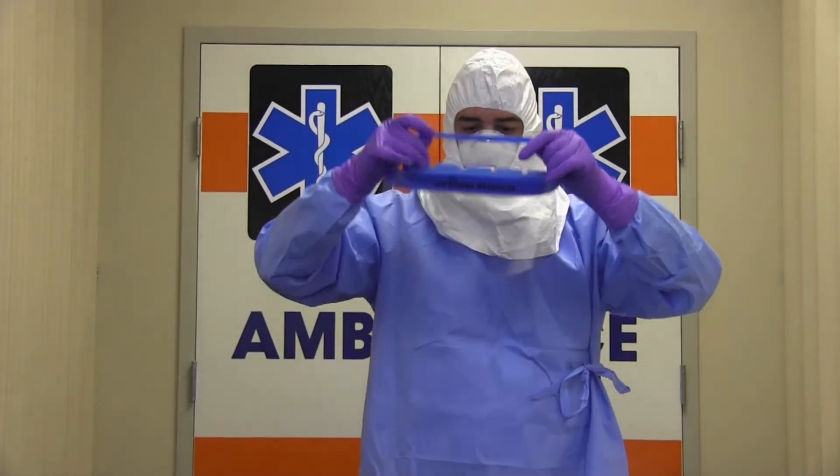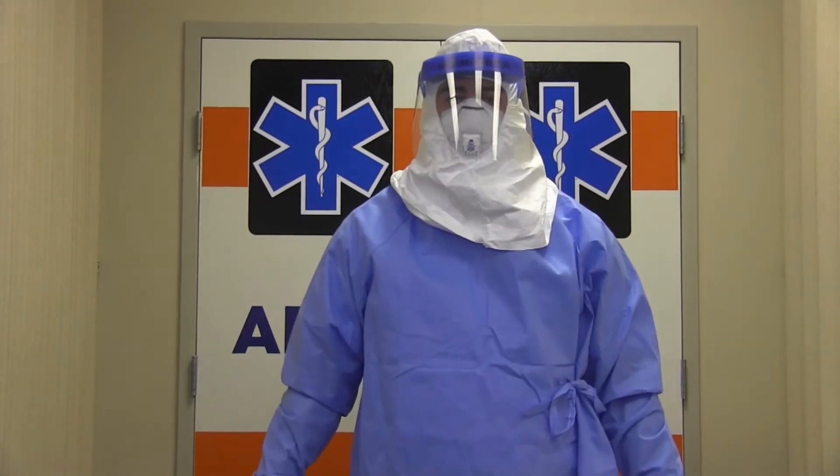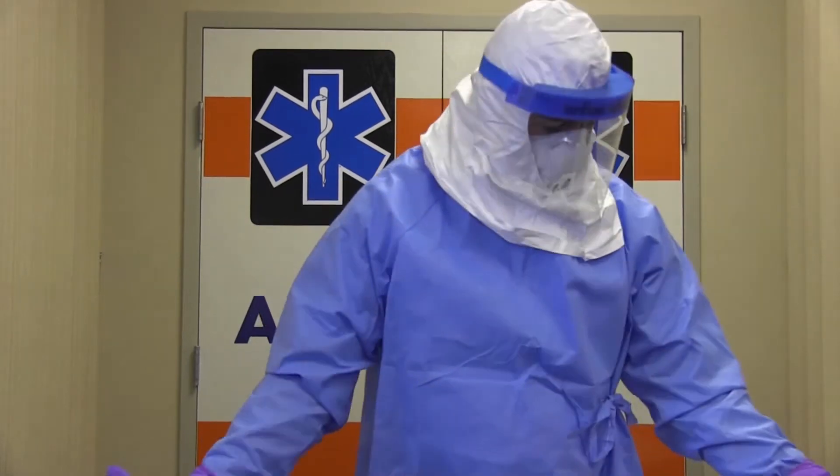Now you'll put on a full face shield over the N95 mask and the surgical hood to provide additional protection to the front and sides of your face, including your skin and eyes.